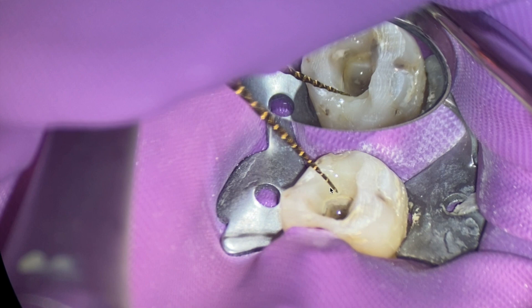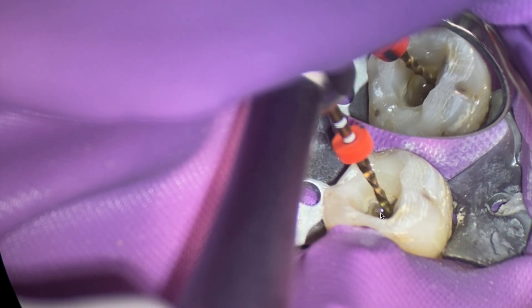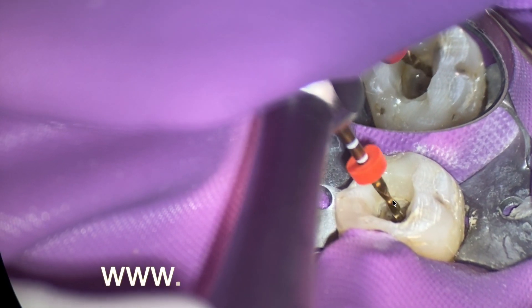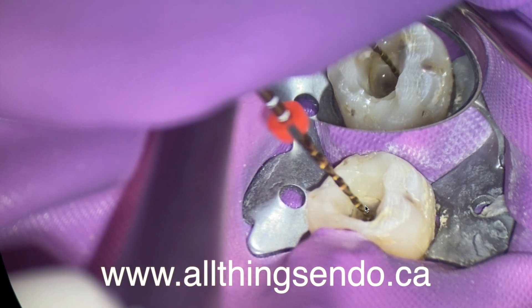So what I'll do is — you can see that we're actually not even down to working length. We're just opening the coronal two-thirds. What I had sensed was I had my glide path with a size 10 file. You can see what we're trying to do is open to the coronal two-thirds, just like we talk about in our course at allthingsendo.ca.